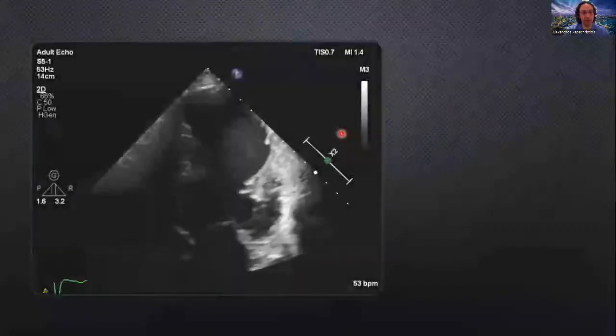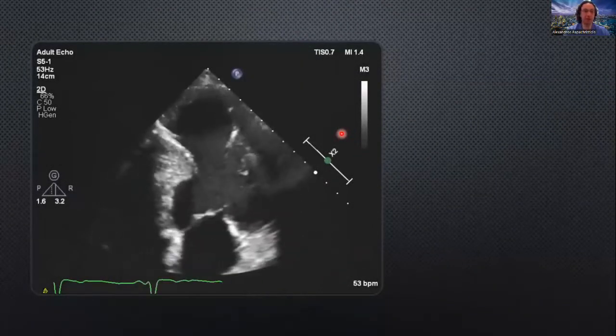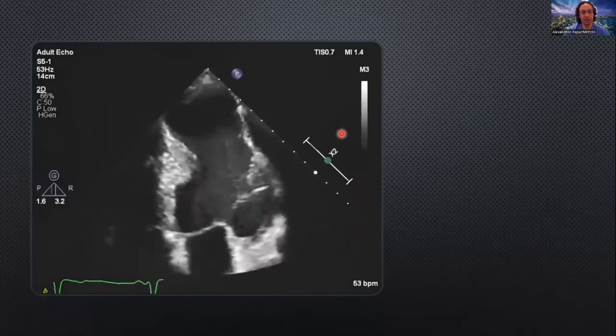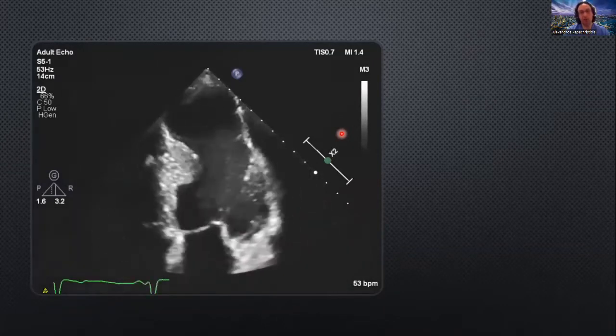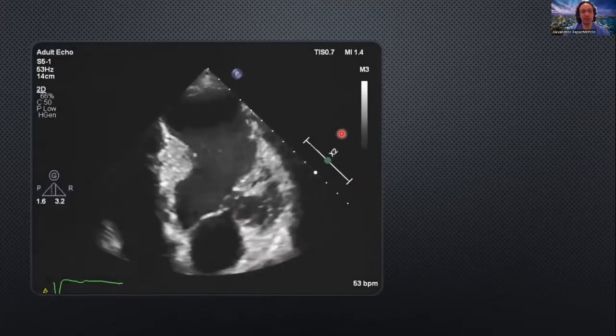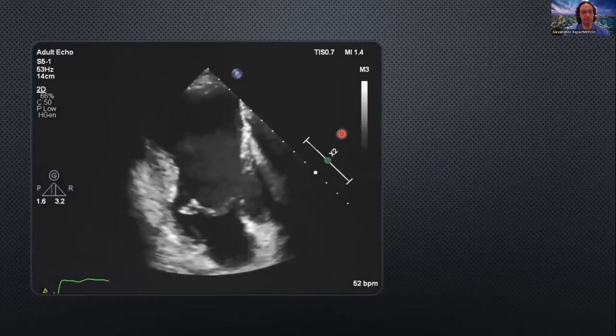Another patient with a large LAD infarct, and this is one of the cases I'm pretty sure that everyone has come across, the eccentric apical aneurysm. You need to struggle to get contrast there. You need to be very cautious with your boluses and the flushes, but also the gain and the mechanical index.